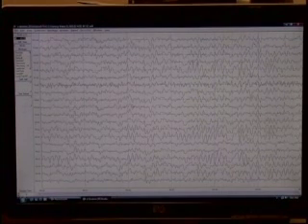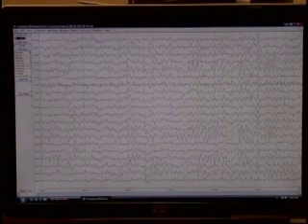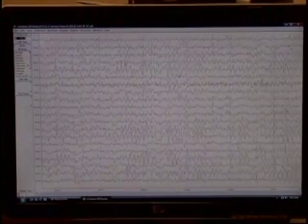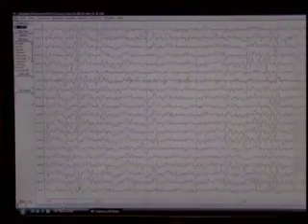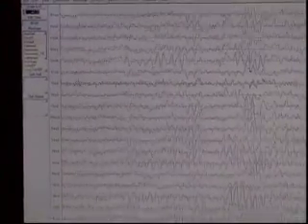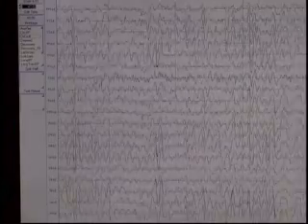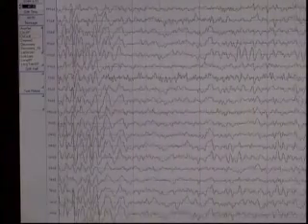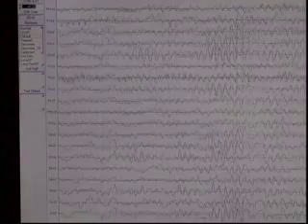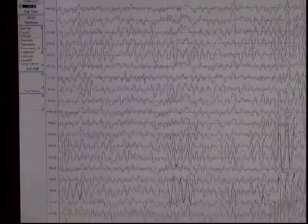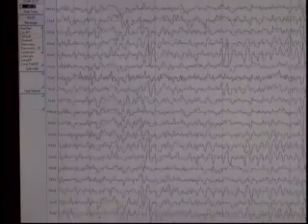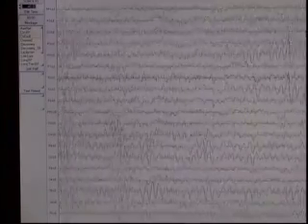We can then scroll through the file left to right, and we're seeing the various alpha activity — waxing and waning, and changes in state. But this basically looks like a very good EEG recording; everything looks the way it should. So we can proceed to do a little bit of analysis.